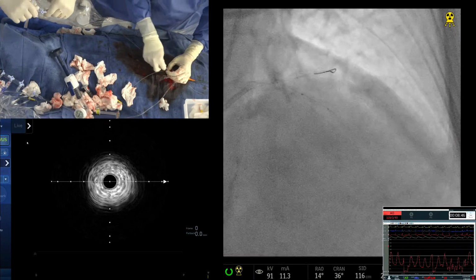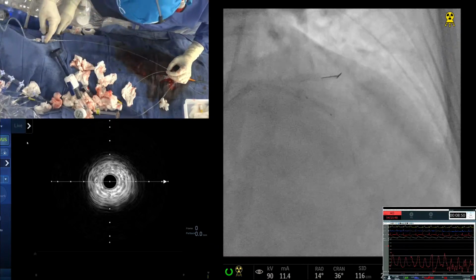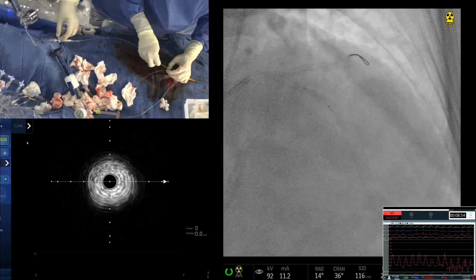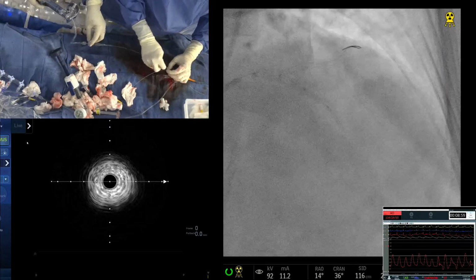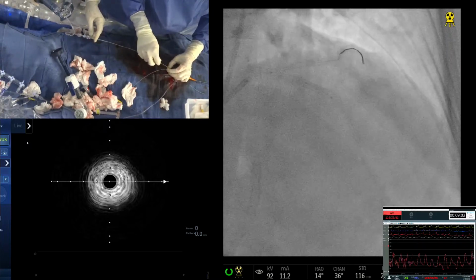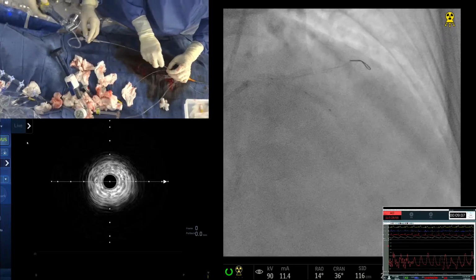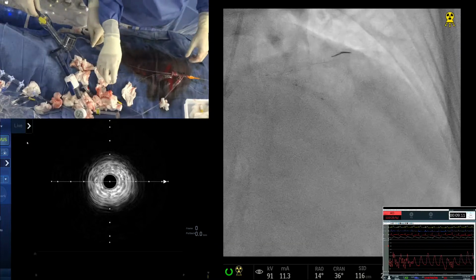So I think what happened is that I was a little involved with something else on Zoom. After your initial little trouble, you go to the Corsair. Corsair will take you through. Not a problem, and that's what we did. Is this again a used balloon you gave me? No, it's a new one, right? One second. Okay, good. Yeah, it'll go. Bring the other one now.